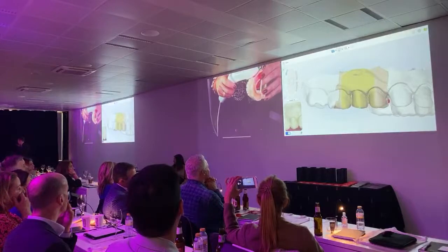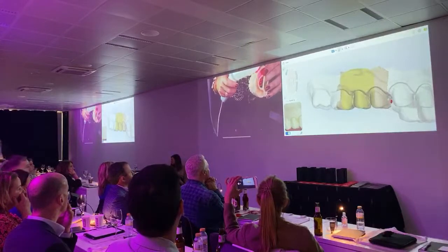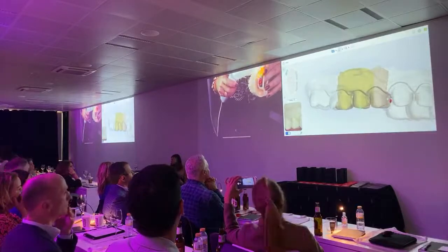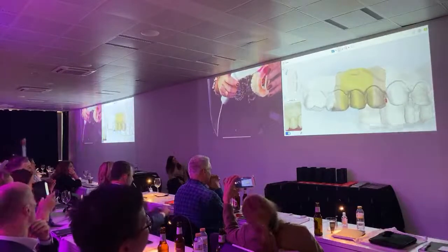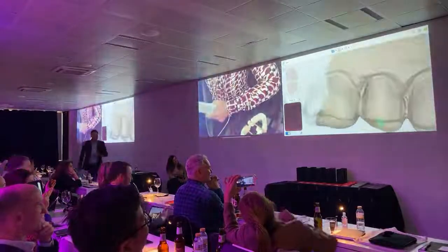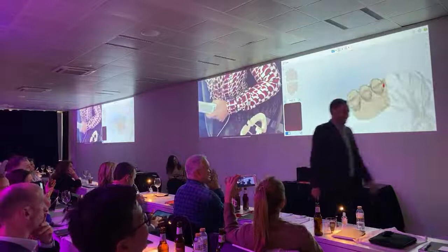Why is this happening? Why is it becoming better? Because I'm giving more triangles to the image. So I'm going to have a better STL for Angelo. Thank you. Okay? And then here you need to scan again.